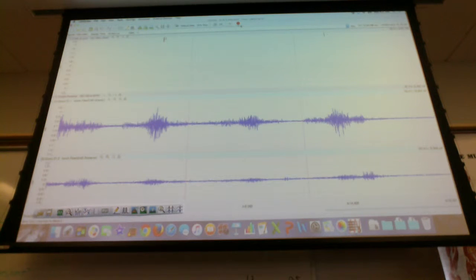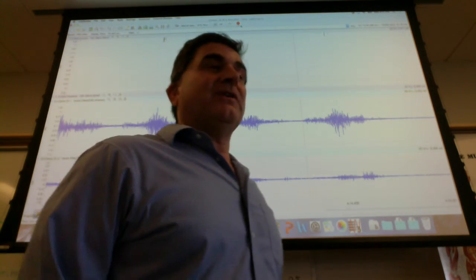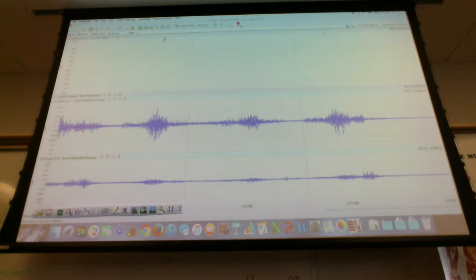Okay, so you guys, this one looks good, right? All right, so what we're going to do next is try to get an idea of the scale of what's going on here, and we're going to measure things. You'll notice we have the various windows there. Some of them go from like 1.2 to minus 1.2.